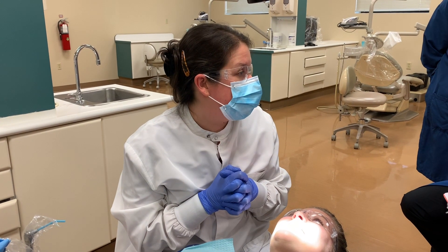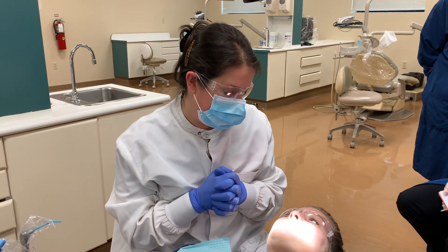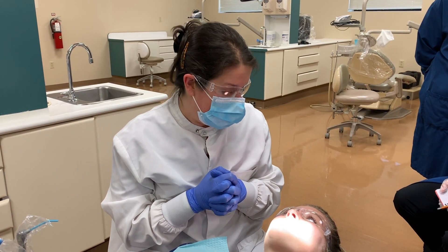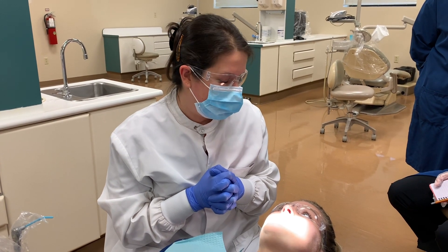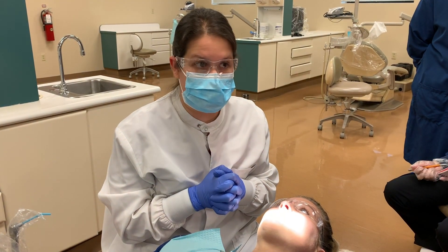There are three reasons that we provide a fluoride treatment to our patients. One is to prevent caries, one is to remineralize demineralized areas, and the other reason is to decrease sensitivity.